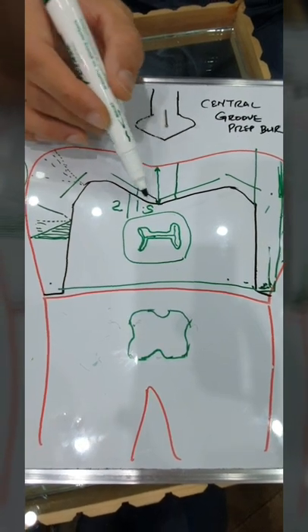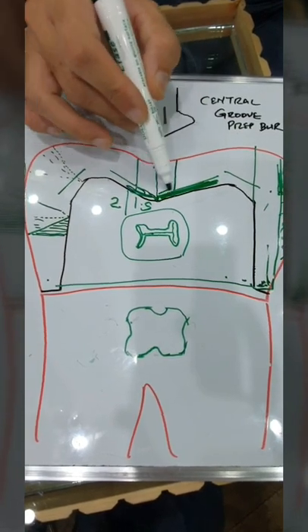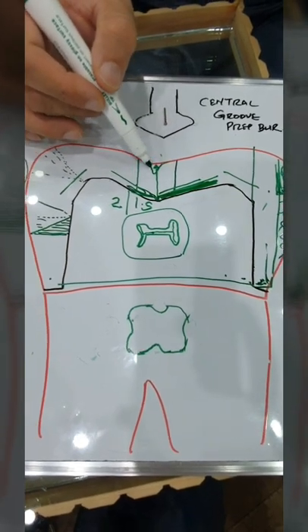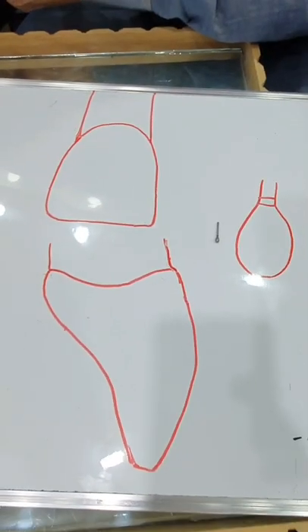And when the lab goes to make the crowns, they can put 0.5 millimeter or 0.4 millimeter of metal. Then they can put the opaque layer up on top and the rest of the porcelain. But even in the porcelain, I want them to put the grooves so we can have good anatomy and the staining in there. Now here we have an example of an anterior tooth.